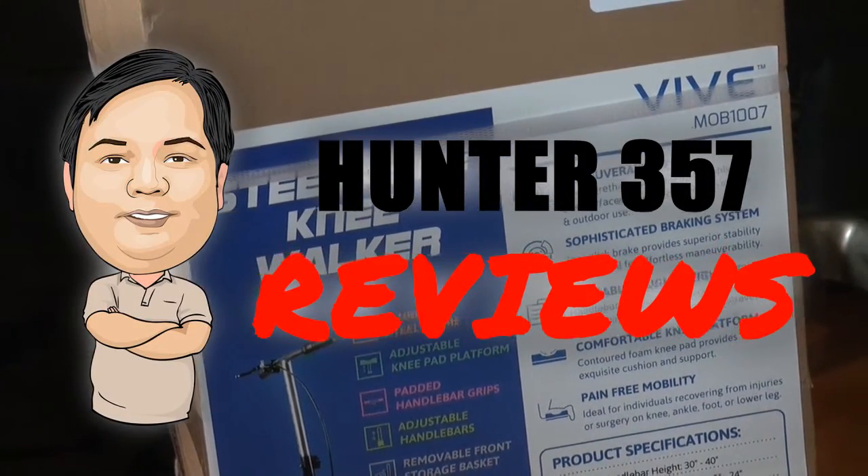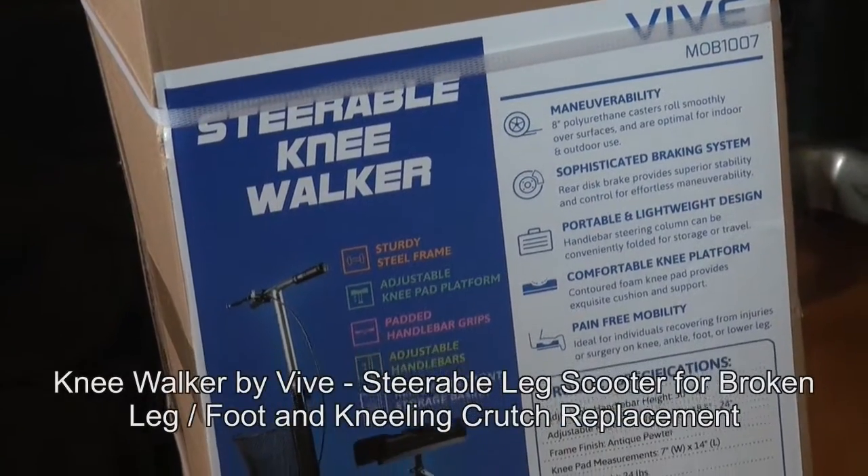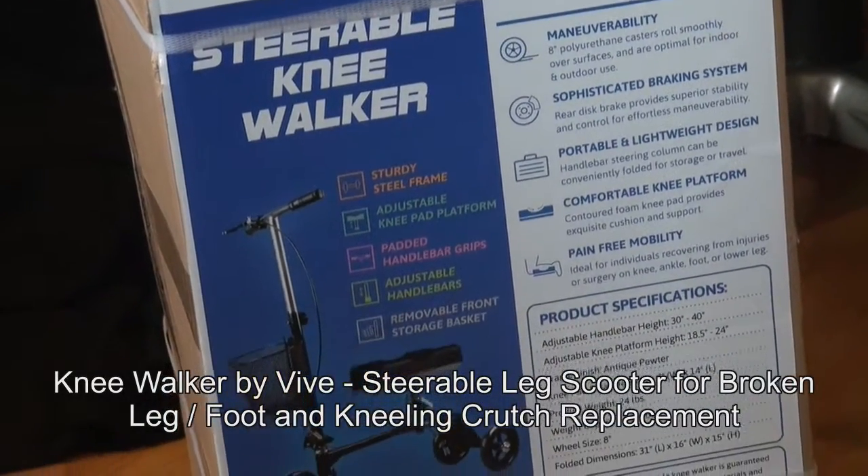Hello! Good day! This is Hunter357 and today we're going to review the Steerable Knee Walker by Vive.